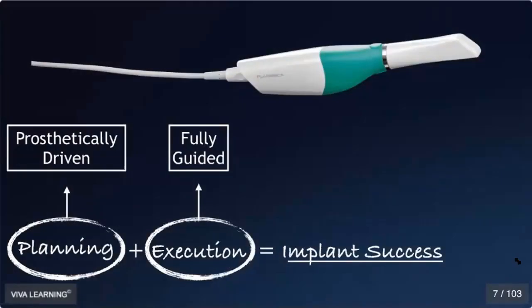So here's my strategy and my formula: success on a daily basis in the implant practice is really based on doing prosthetically driven implant planning and fully guided execution of implant placement. There are a few technologies that we're using day to day to make this happen. The first in my hands is an intraoral scanner.